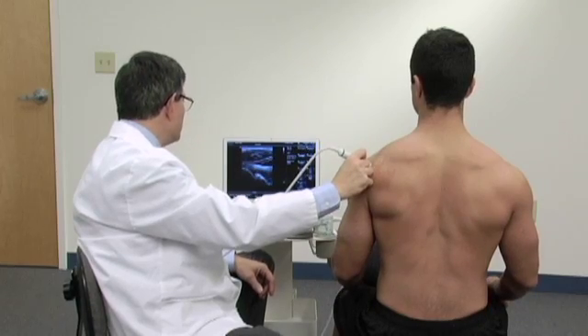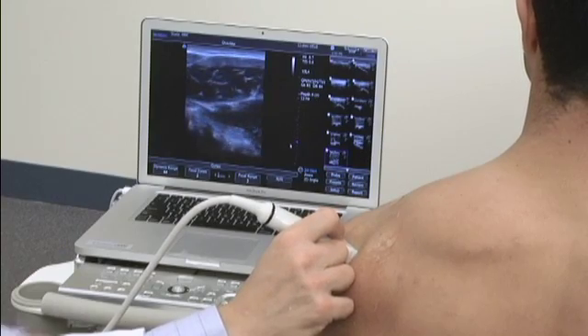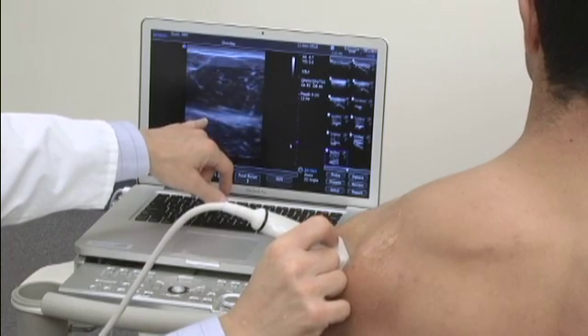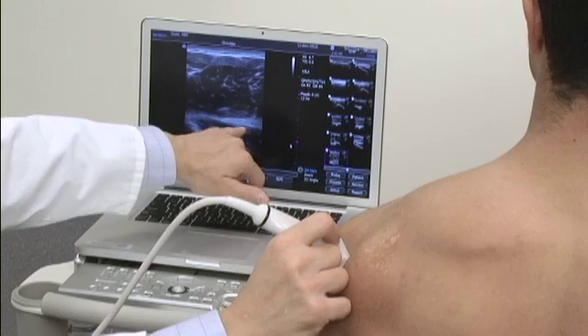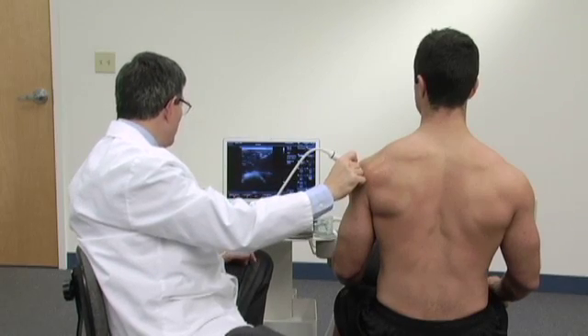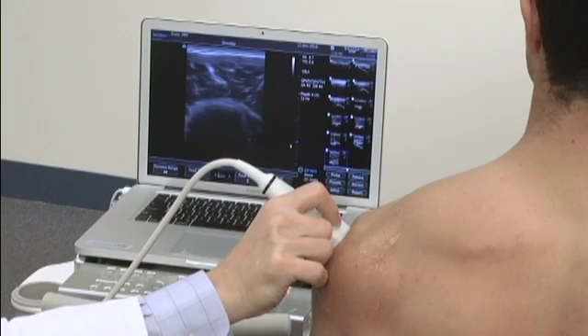If I angled the probe down slightly or slid the probe a little more distally down his arm, we'll start to see the tendon of the teres minor, which is more peripherally located in relationship to the muscle. Likewise, we can follow it out to where it inserts on the posterior facet of the greater tuberosity.